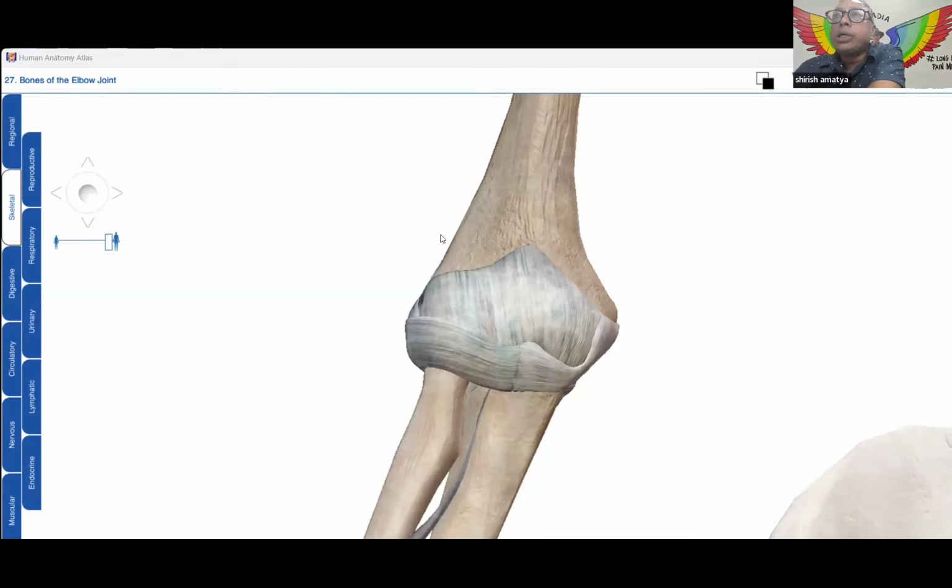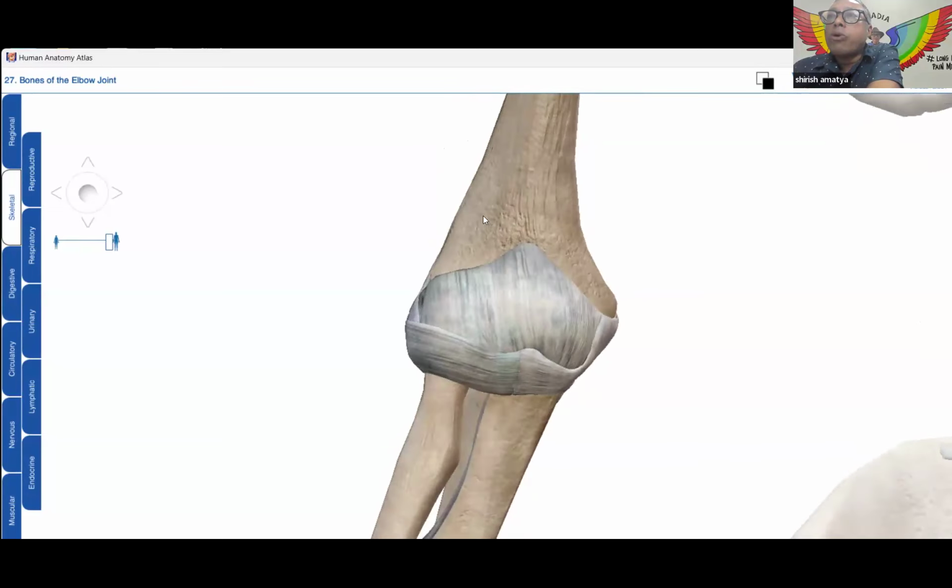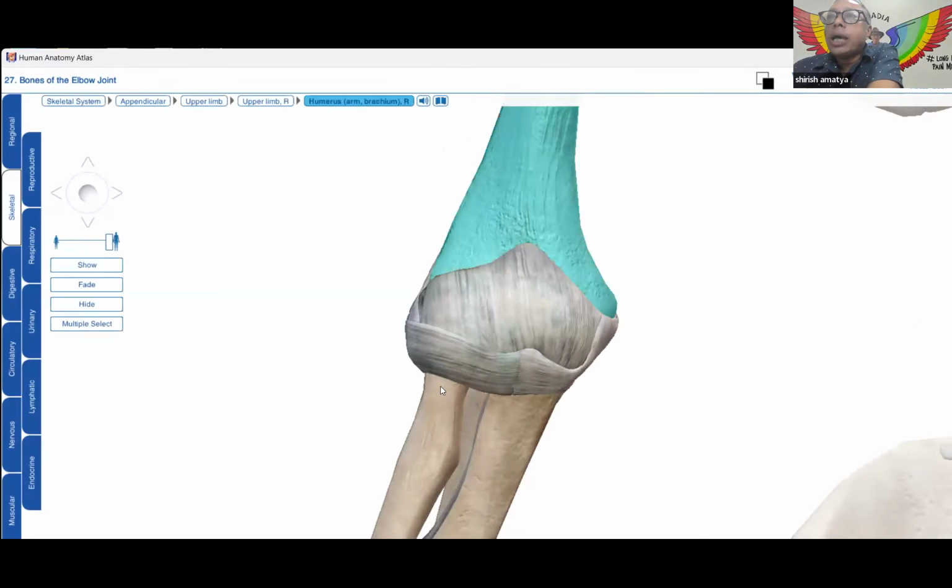Okay. So today, to diagnose the disease or to elicit history, we need to understand the anatomy as well as the sono-anatomy of the patient, both to be able to diagnose and for treatment purposes also. Basically we all know the elbow joint is formed by the distal end of the humerus and the proximal part of the radius and the ulna. The ulna is in the medial aspect and the radius is in the lateral aspect.